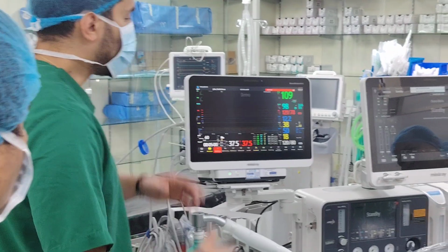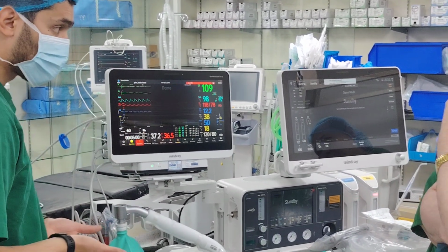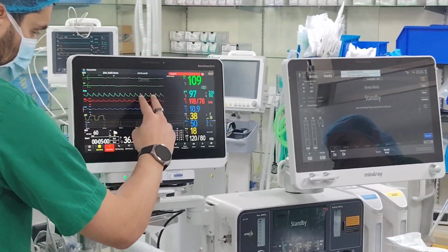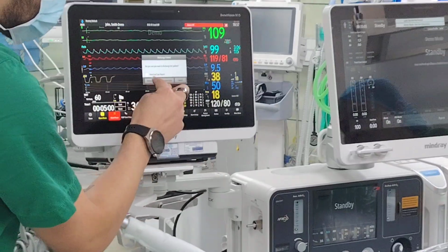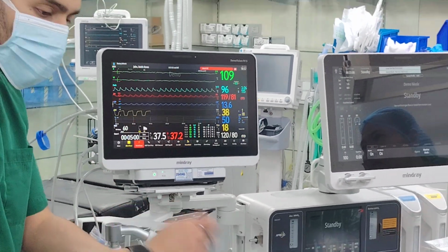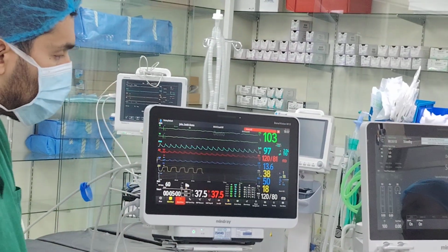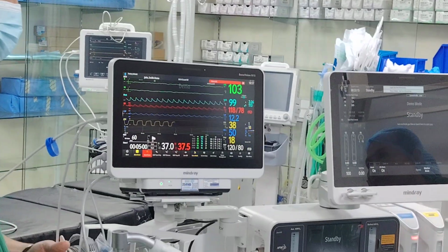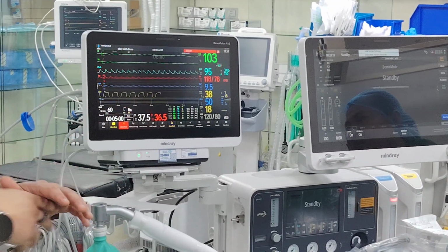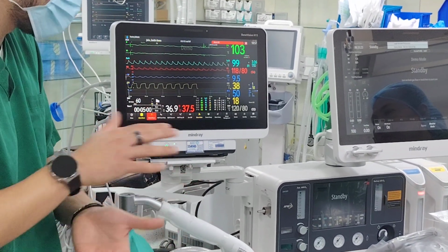Okay? In case you want to discharge a patient, which I highly recommend you to discharge a patient because the file will be retained or organized better, 2 fingers up like this and press discharge. Okay? Why? Because in the future, you are writing documentation with your hands. Inshallah, soon it will do the EMR. Okay, I already spoke, I was in Dammam yesterday for the branch. They're fixing the security problem. There was some kind of security problem. Once it's done, then our machine can send to your local EMR or the HIS.